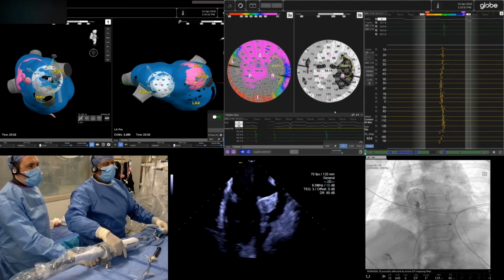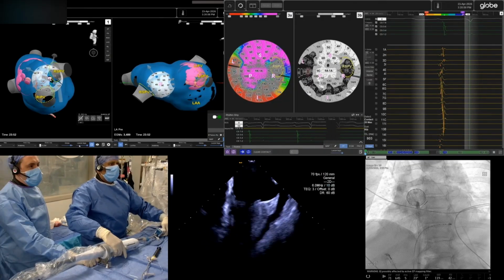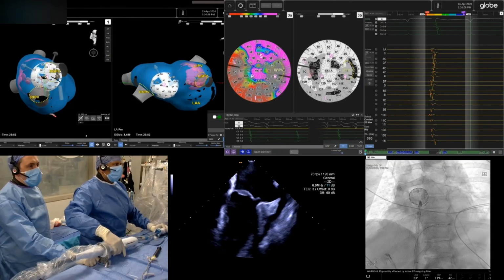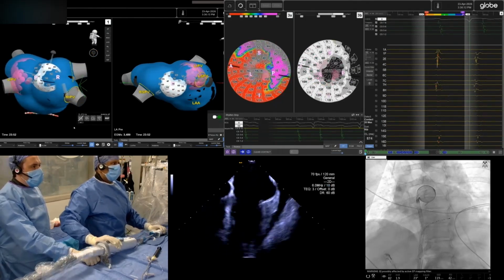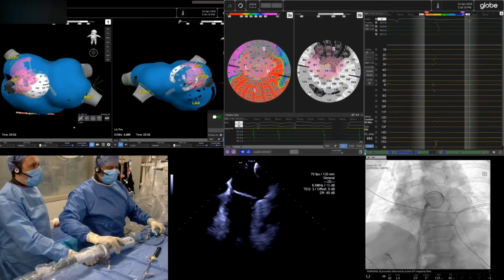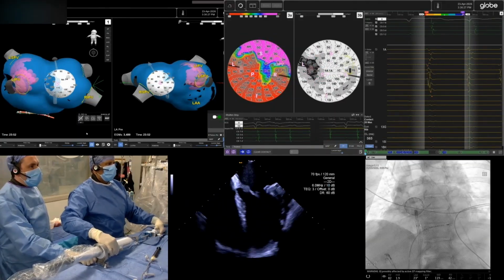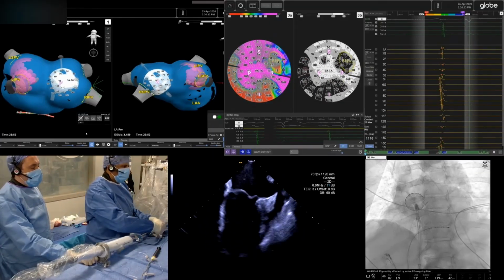I just want to, as you keep going, Srini, I just got a message. It turns out that it is unipolar, but it's unipolar against all the other electrodes. So all the other electrodes act as a composite virtual electrode, and that's how this works. Okay, that's going too far there, so let me go back. What's interesting about this technology is that it's a big ball. There are electrodes everywhere. So all you have to do is get it to that location, and once you have it there, you can just pick the electrodes that you care about in order to do the ablation.